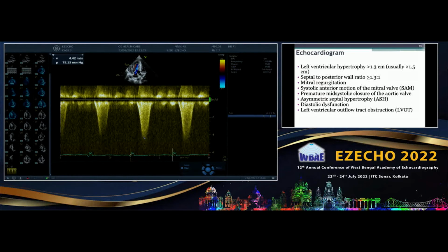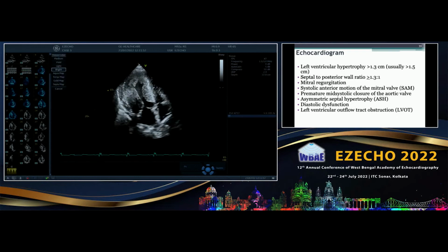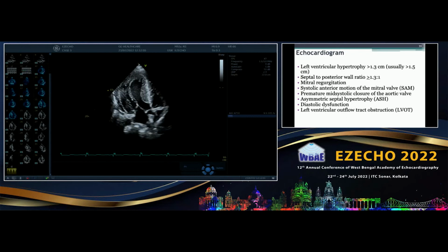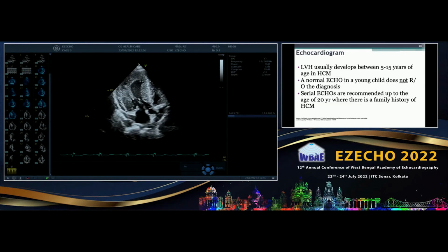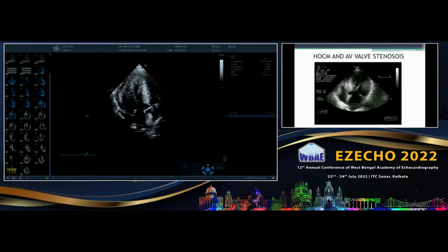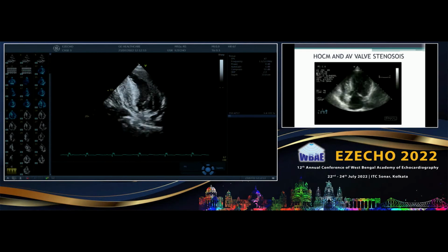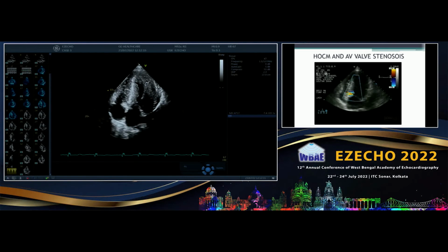But before that, I would like you to go and do a good GLS on this patient. Always do a good GLS on this patient, because if you have got an apical sparing, think that this is an HCM mimicker. Don't go just by asymmetry. ATTR amyloids have a lot of asymmetry. So having an asymmetry doesn't mean it is a sarcomeric HCM. That is one important aspect. And even having a dynamic LVOTO also doesn't tell you that this is definitely a phenotype of a sarcomeric HCM.